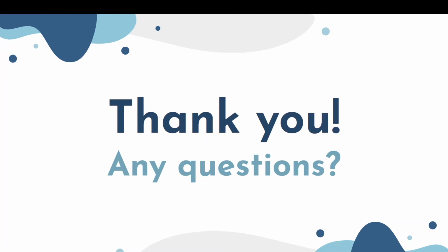You have your Butterfly, so maybe you can demonstrate that and help us with that, that would be great. You like it? So let's send a thank you for helping us with this. We'll demonstrate and then we'll get everyone hands on. If Tamara is also here, if you want to talk, then we can get two things going at once.